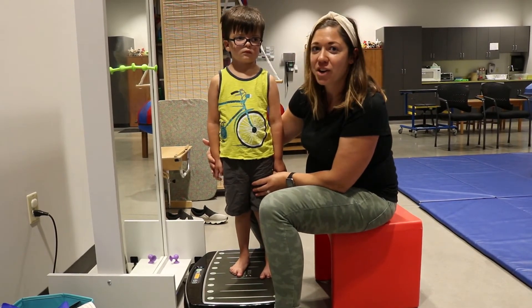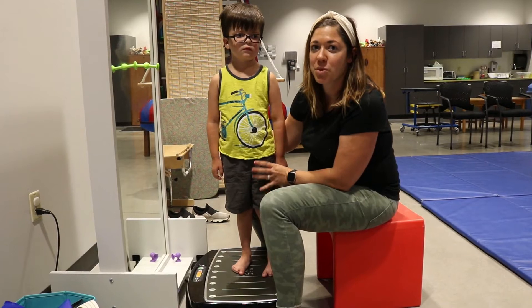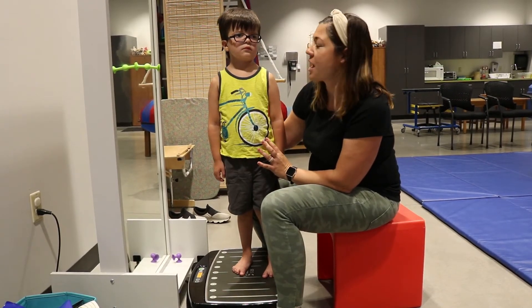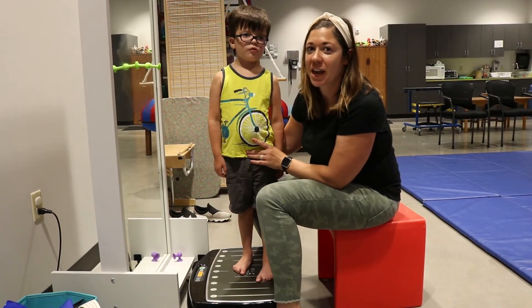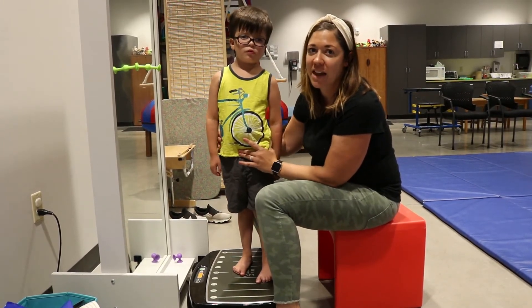As you increase the frequency, you work on strengthening and posture. And the highest frequency works on increasing range of motion and decreasing tone, for those who have higher tone.